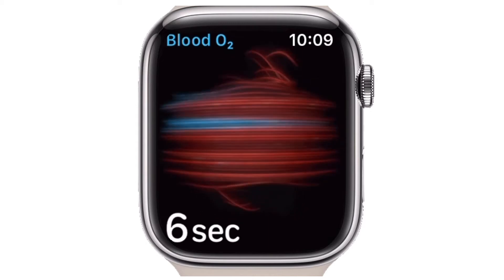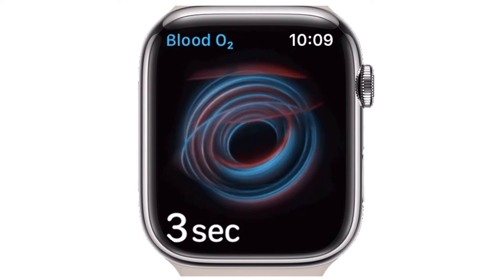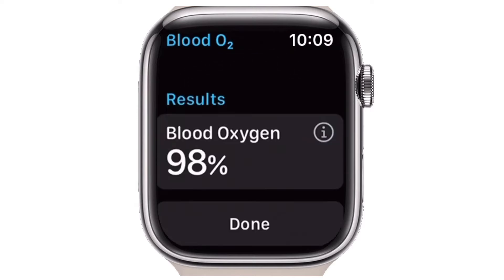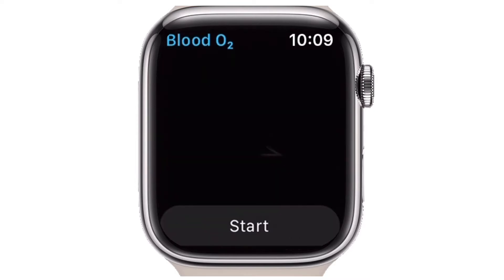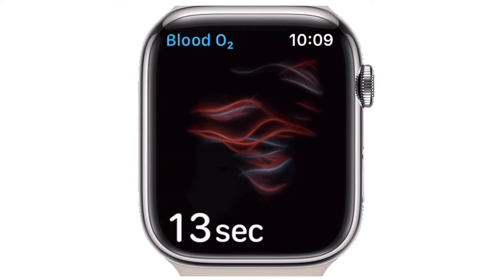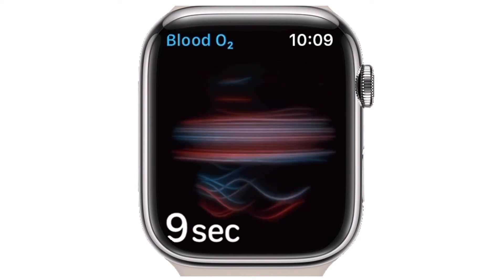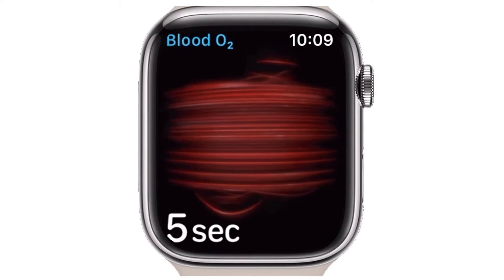This is a feature on the newer Apple Watch models and it's pretty straightforward to use. For those who aren't aware, a pulse oximeter is a device used to determine your pulse rate as well as the oxygen concentration in your bloodstream. This device is in high demand these days due to the global COVID pandemic, but if you have an Apple Watch Series 6 or later, you don't need one, as it can do both those things with its internal sensors.